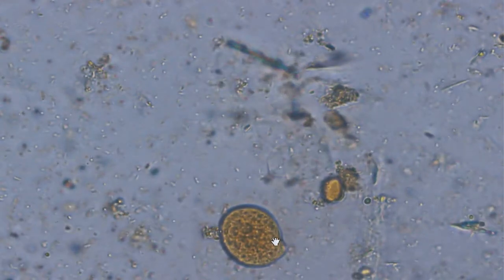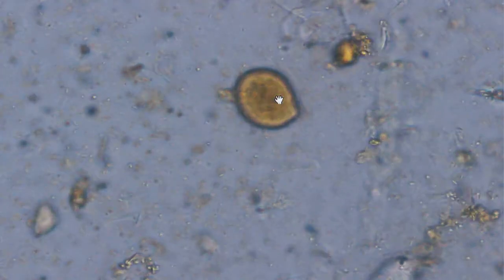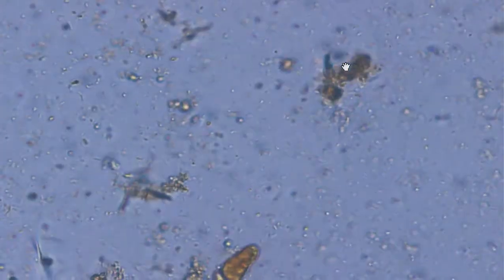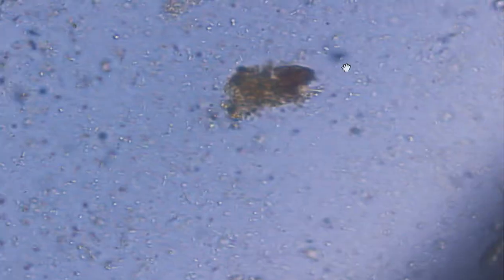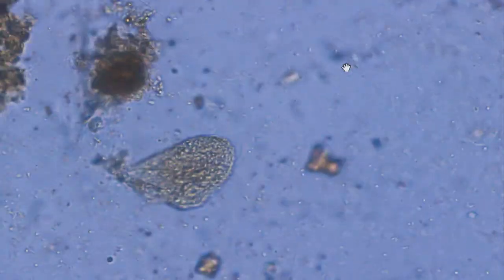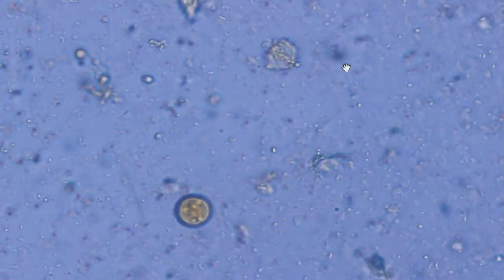In this case here, it's really stained up the cytoplasm and it's actually made the nuclei more difficult to see. That is a cyst, believe it or not, but not in very good shape. These are all formalin preserved. None of these are actual live fecal samples that I'm looking at here. But you may find iodine helpful in that it can improve the visibility of cysts and trophozoites in a sample and improve access to the nuclear morphology. Now here's an interesting one.